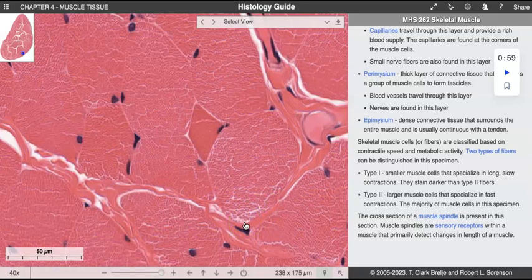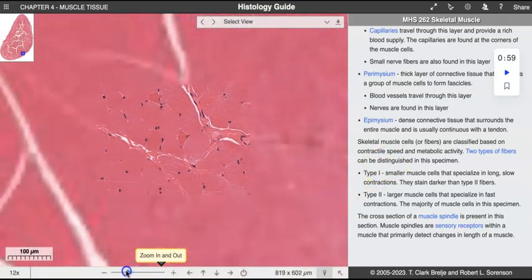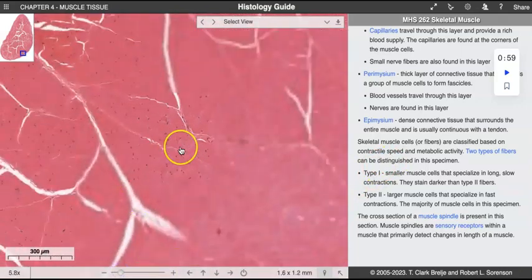Whether we're looking at blood or we're looking here at muscle, you want to be able to say, okay, this is one individual muscle cell. These are the fibrils. This is the non-living protein, but the whole cell is a living unit. And here's another, and here's another, and another. So hopefully that was helpful in looking at both a longitudinal and the cross-sectional view of your muscle.